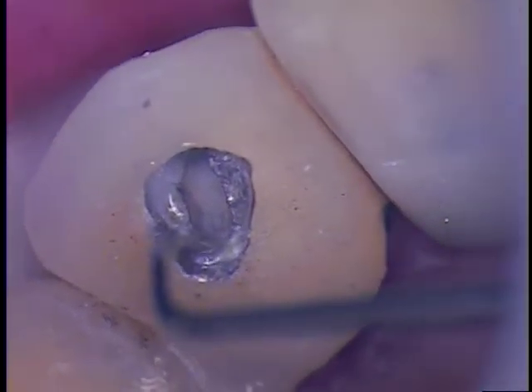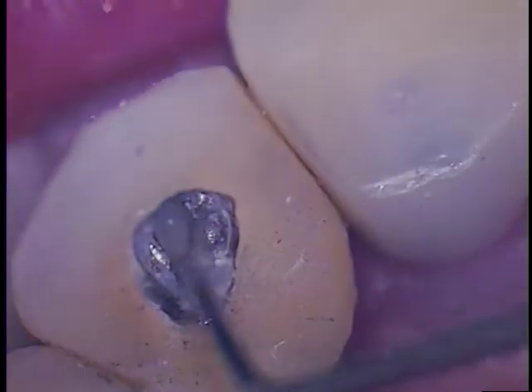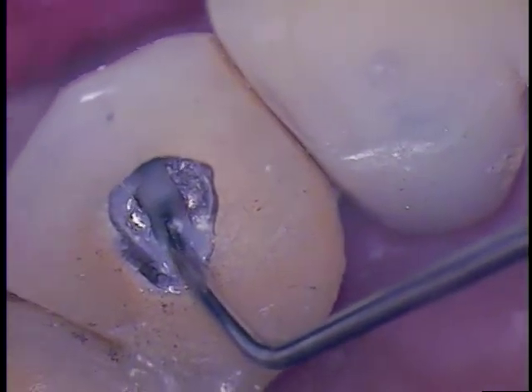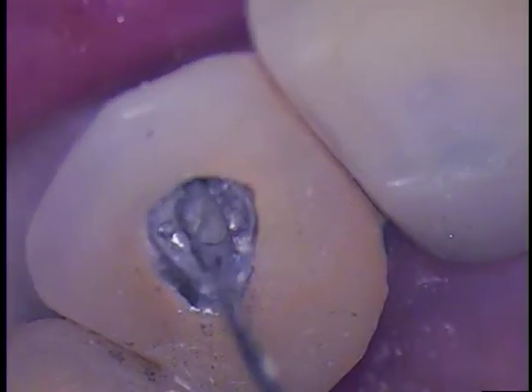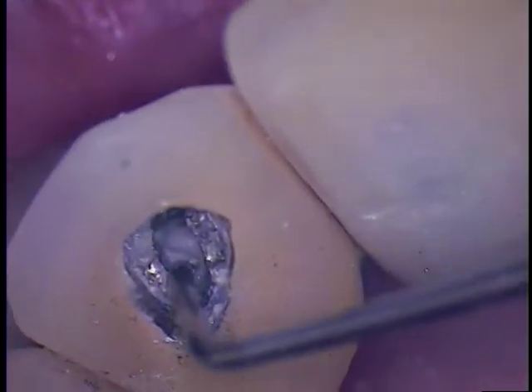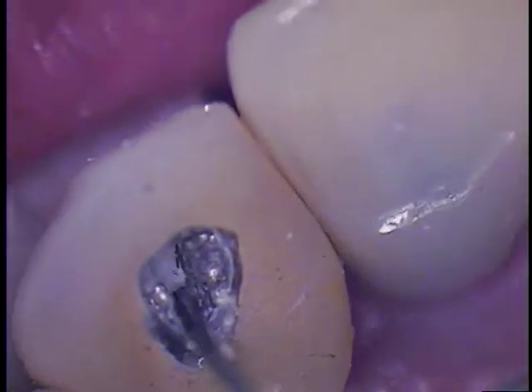You don't want to get it on tissue. I keep checking with my patient — are you okay, Dom? Before we had a little on his tongue and he felt it; he was burning a little bit, so we cleaned that off in a hurry. It's a pretty strong acid material — just like a very strong vinegar. It's just working slowly on things.